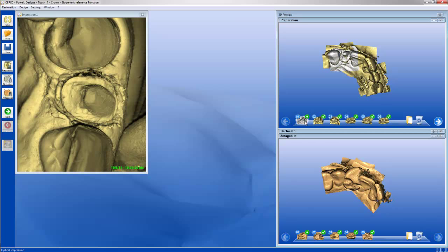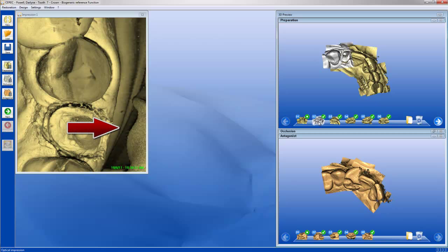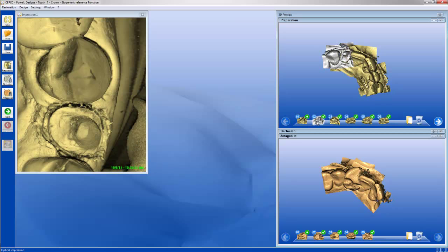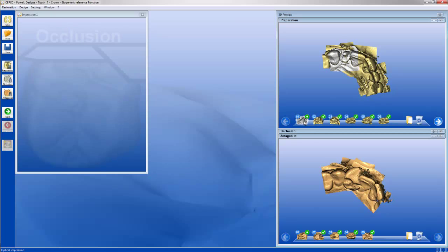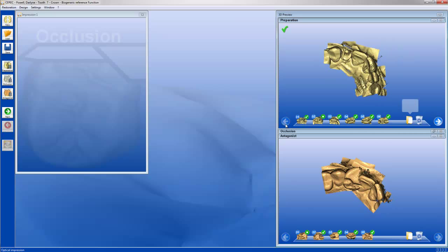So that's a good looking image, but one thing I want you to notice, look at the edge of the buccal part of that tooth. You can see there's a slight shaking of the camera. You see the little jagged edges towards the right side of the screen there. We've got another image. This is better, but again, just very, very subtle. You see the jagged edges on the right side of the screen. I mean, not terrible by any means. This image is better than this image. So maybe what I'll do is I'll probably just end up getting rid of this image over here because it's redundant. So let's just go ahead and put it in a save folder. Now it looks like we need that to stitch the model, so we'll put it back in.